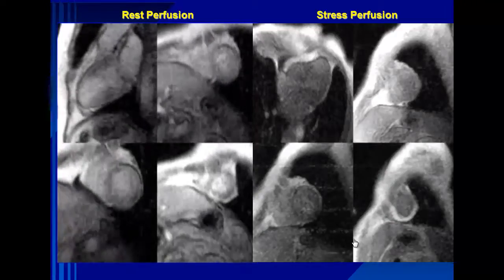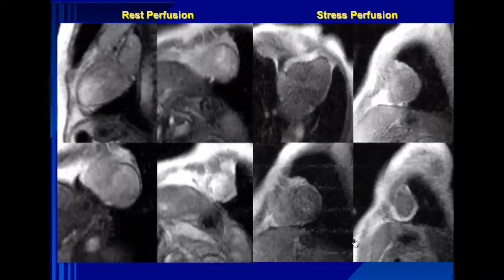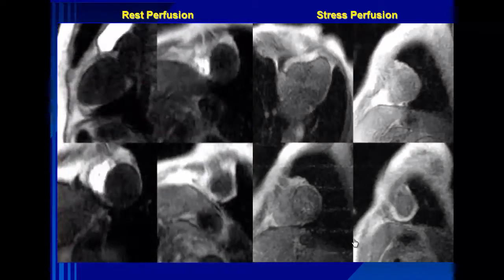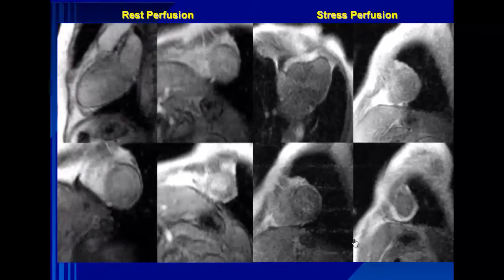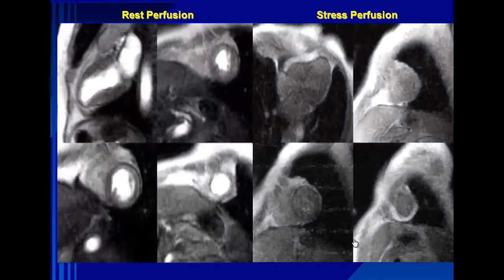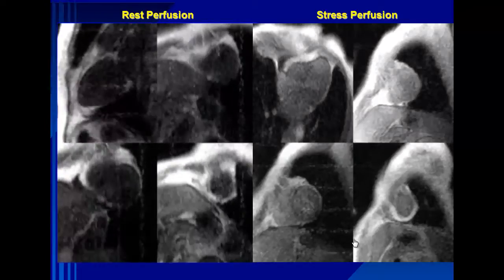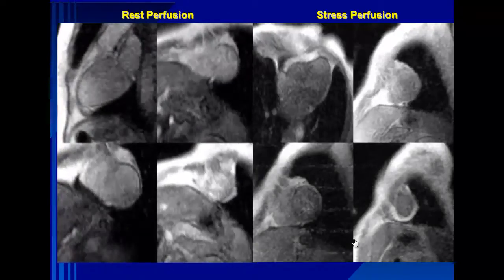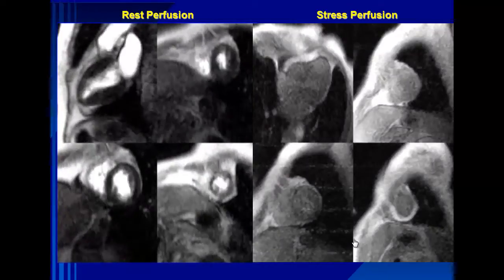So basically what we're doing here is we are imaging the same part of the cardiac cycle in multiple beats. So you're not seeing systole and diastole. And we then inject gadolinium. And focus on the fact that you can see at first pass, which means the first thing you're going to see is on the right, then on the left, and then you're going to see it in the myocardium. Okay? And this is the 2-chamber view, and this is the base of the heart, and there's the apex of the heart.